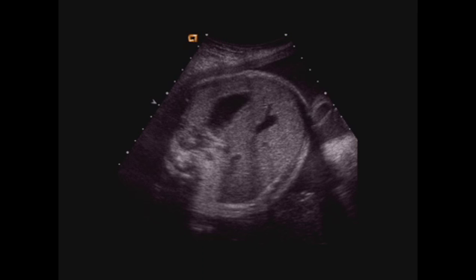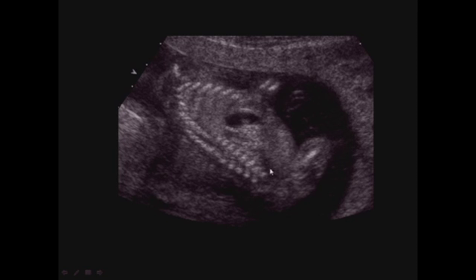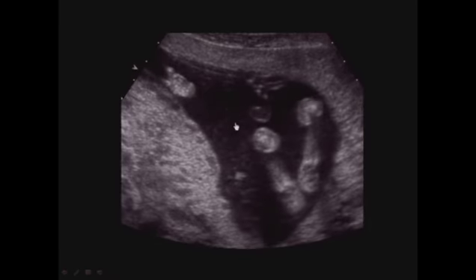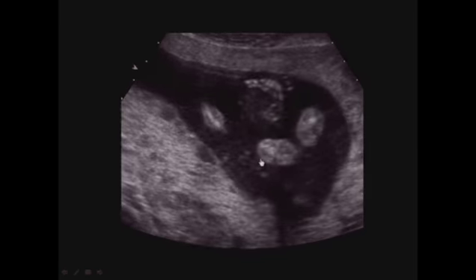Here's an example of a normal stomach. We're all used to seeing this, where it's a transverse view of the abdomen and you have a nice black stomach bubble here in the left upper quadrant. In contrast to this fetus, a little bit earlier in pregnancy, this is a sagittal image and we can see the stomach here and it's got a little bit of stuff in it. Well, the reason for that is on this video clip, you can see there's lots and lots of echoes and debris floating around in the amniotic fluid.